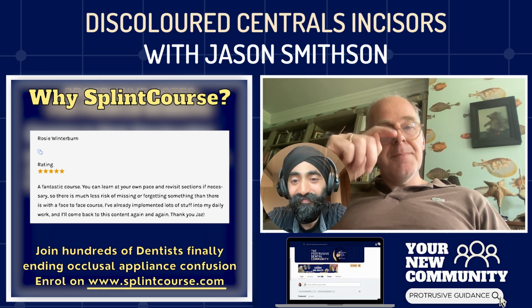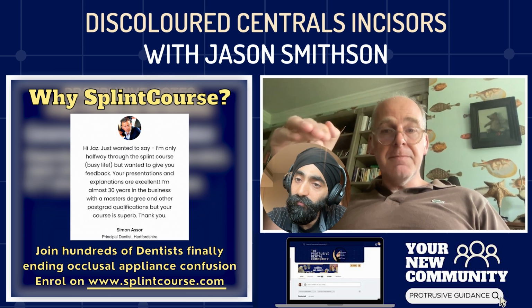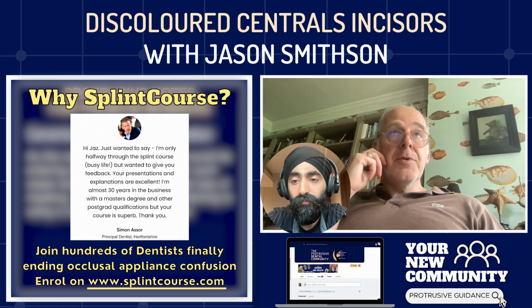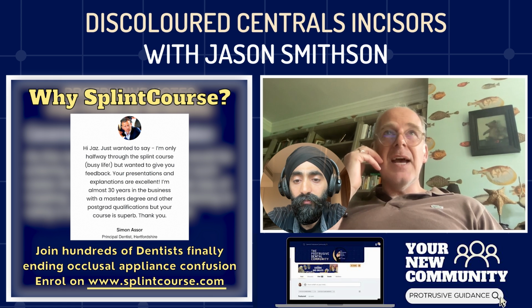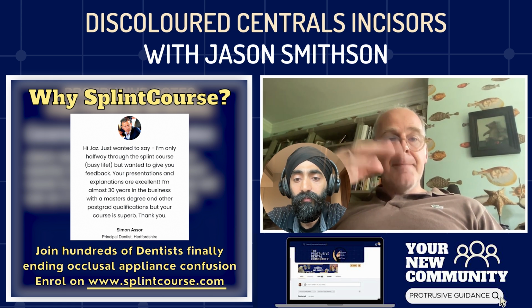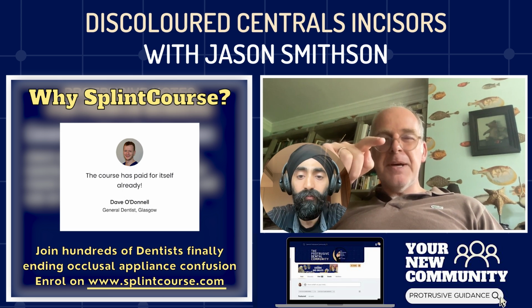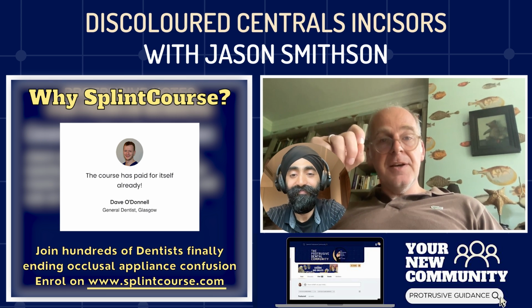Which again might be another reason why I might go down the crown route rather than a veneer route, because I'm prepping quite a chunk off the facial. And the ingot, for most of the cases, and again, because I've got a talented ceramist, we use the MO ingot, the medium opacity ingot. And that's something you need to specify, because most labs will use the LT ingot, low translucency.